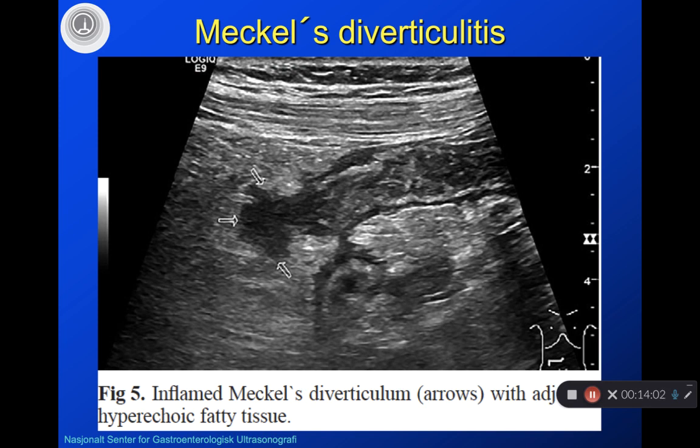Meckel's diverticulitis is a very rare disease. However, be aware, if you detect something like this in the ileum, you should be warned that this could be Meckel's diverticulitis. Classically, there is affection of the peri-intestinal surroundings, the fatty tissue, which gets hyperechoic, and you should refer this patient for surgery.